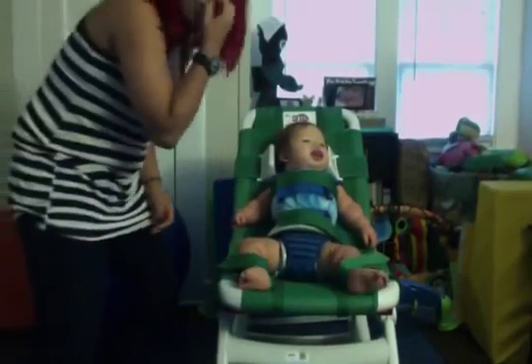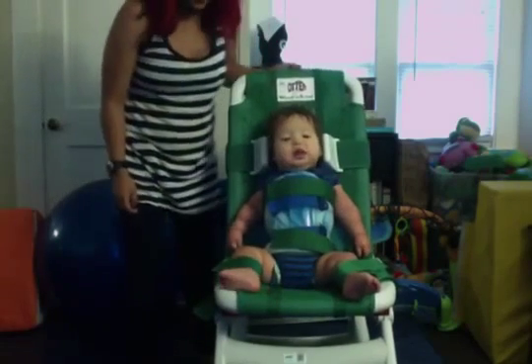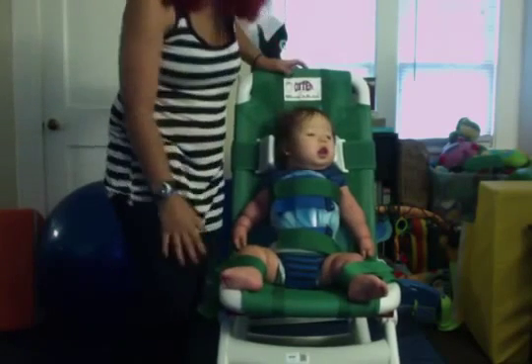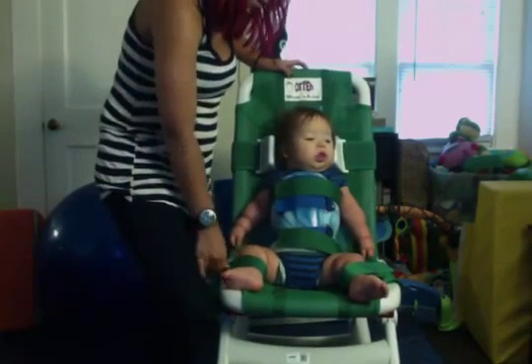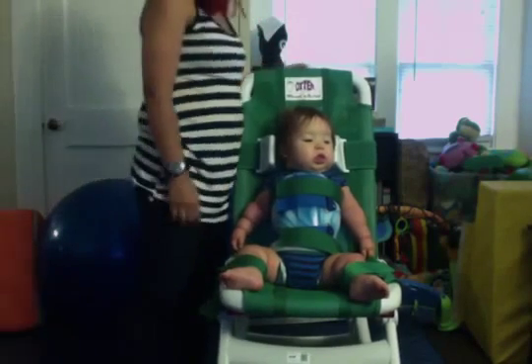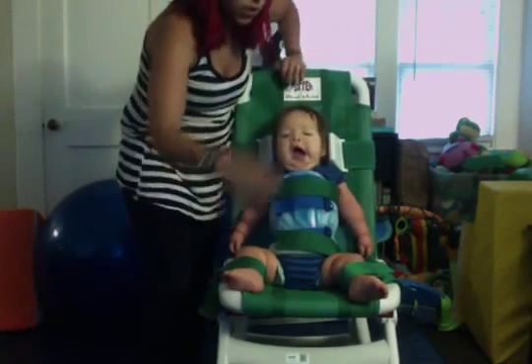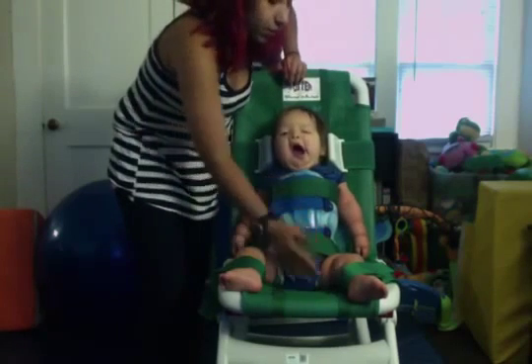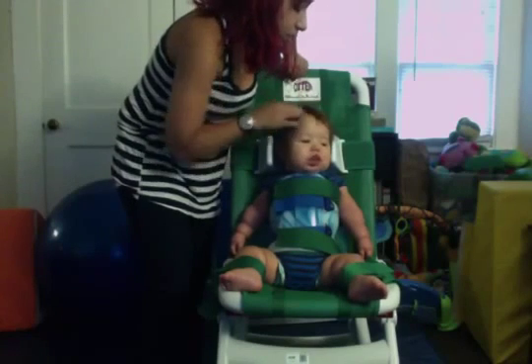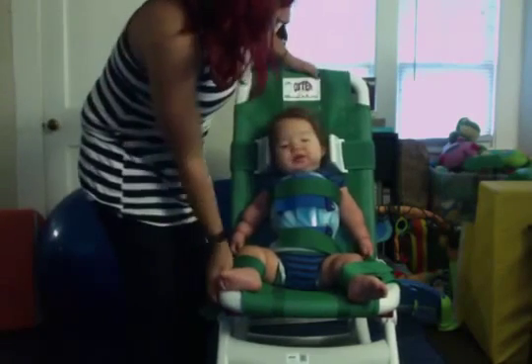That's what it looks like with him reclined in the back of the chair, and he likes this a lot. Obviously you never want to leave a child or person unattended when they're in this chair — that's common sense. We also use a removable shower sprayer to rinse him off, because obviously we don't want water going in his face, ears, or eyes.